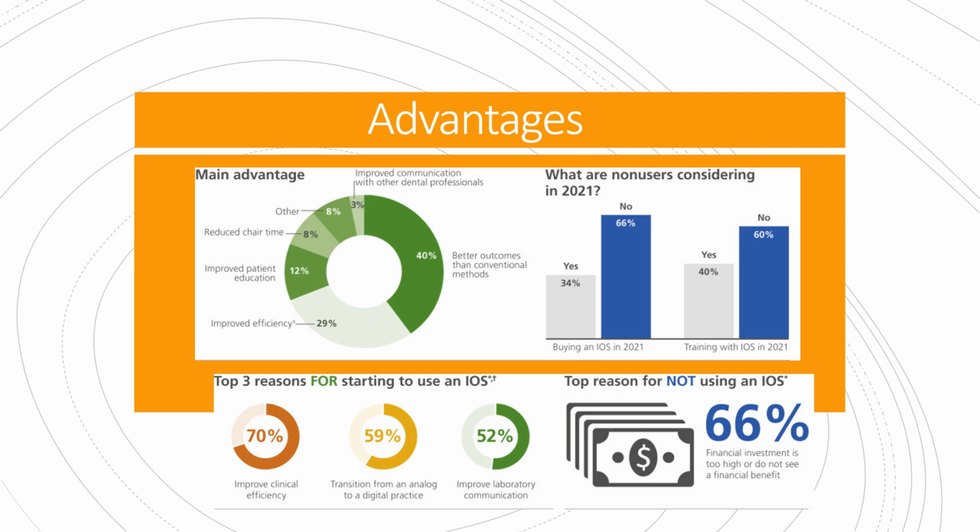And once I had more than one scan in the system, I was able to compare them and show the patient if there was any difference between the two.